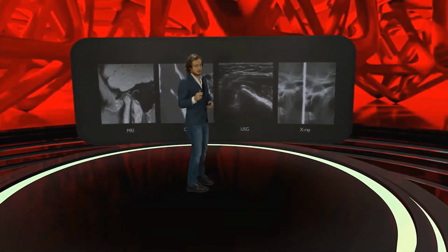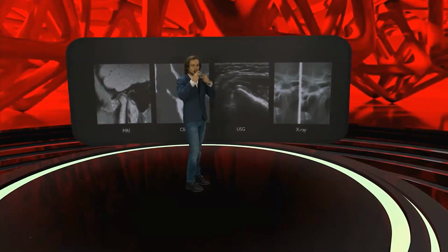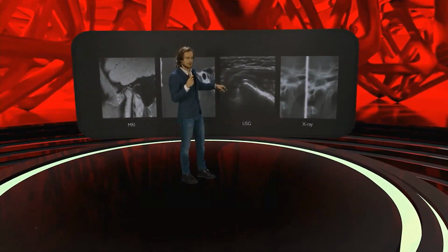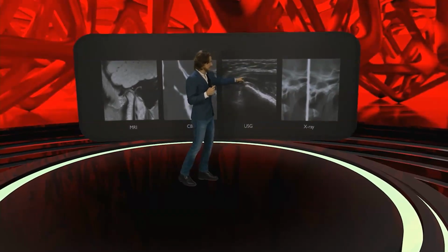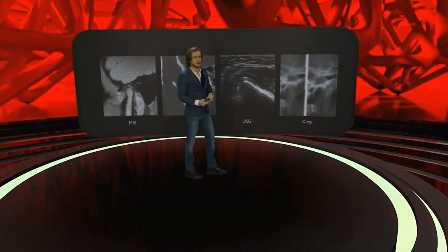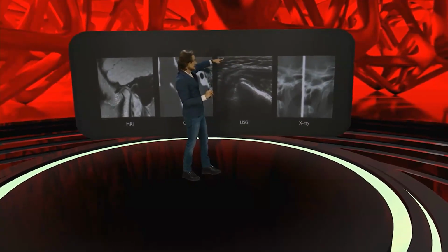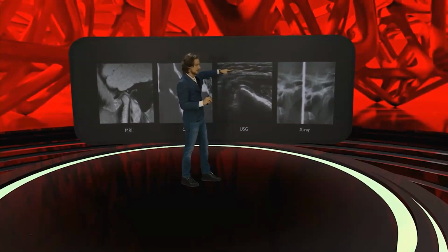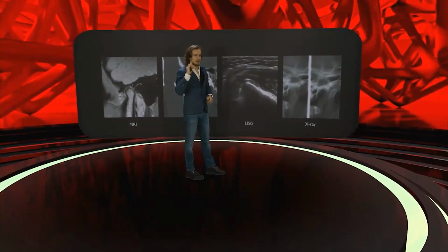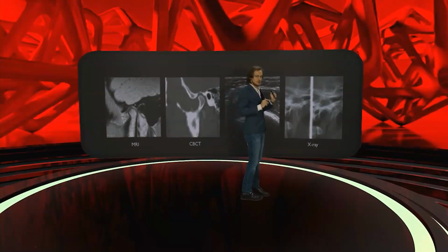The ultrasonography, honestly, I cannot imagine using it, because then my brain is upside down. When you use that, it's not like our typical dental thinking that this is the fossa and this is the anterior part of the head, there is a posterior part of the head. No, nothing like this. When you use ultrasound, the skin is in here, then you go to the muscles, then you go deeper and deeper and deeper. This is a completely different thing. So we'll talk a little bit about that today, but not too much. Don't be too stressed about that.